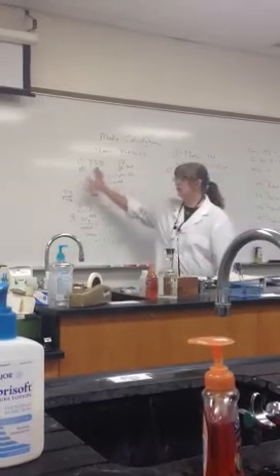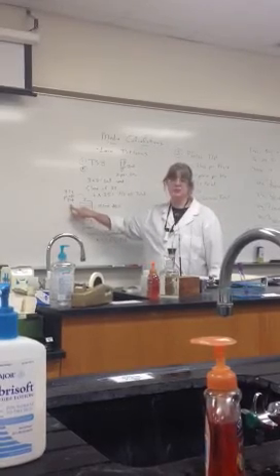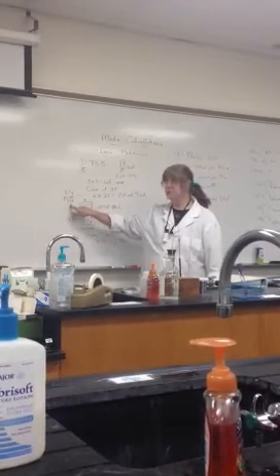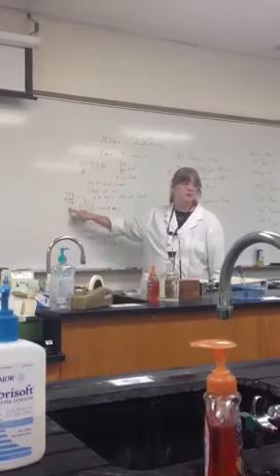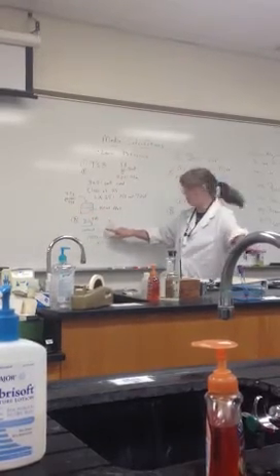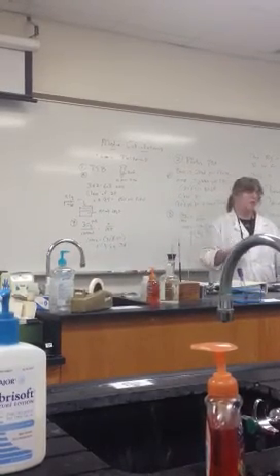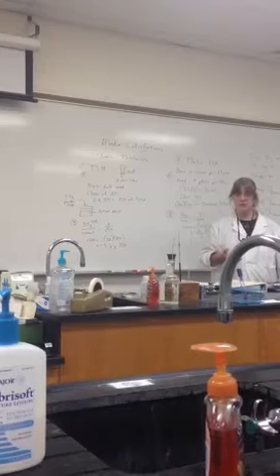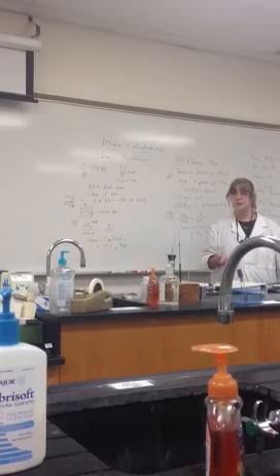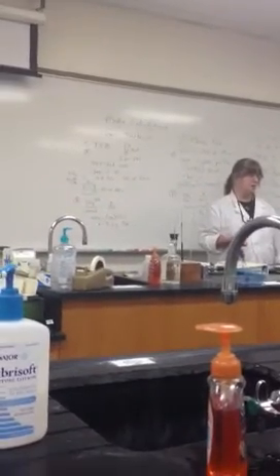So that's the volume. Now you want to find out how much powder to add. This is the answer, by the way. Somebody asked me, where did I get that number from? Was it on the bottle? No, this number's not on the bottle. This number's on the bottle. When I brought a bottle up here to help you out, it will tell you how many grams to add per liter. You should know your metric. A liter is equal to what? 1,000 mils.